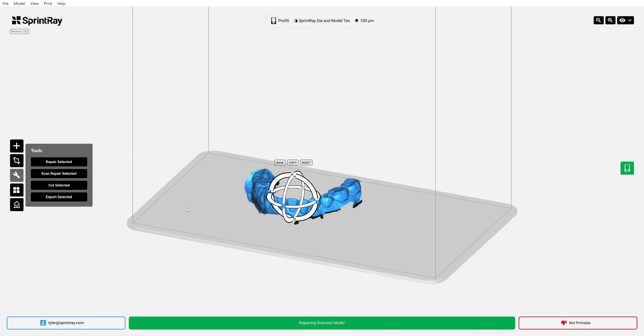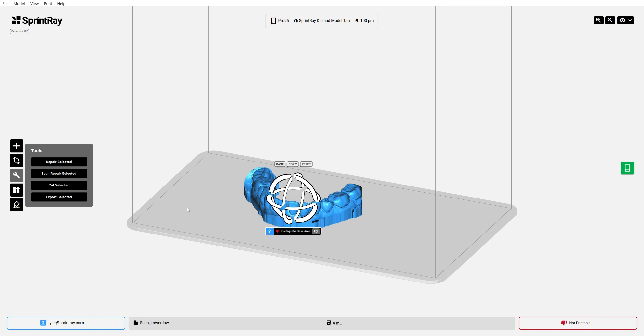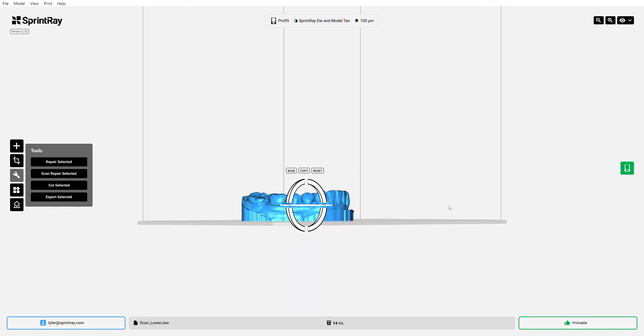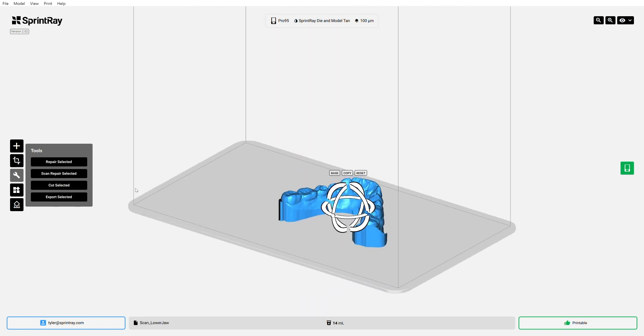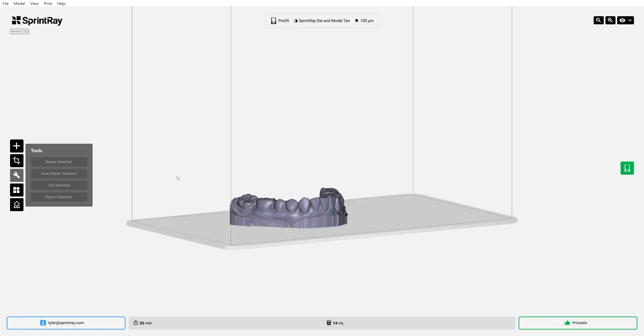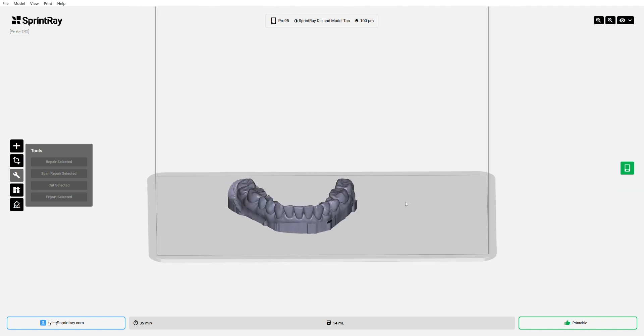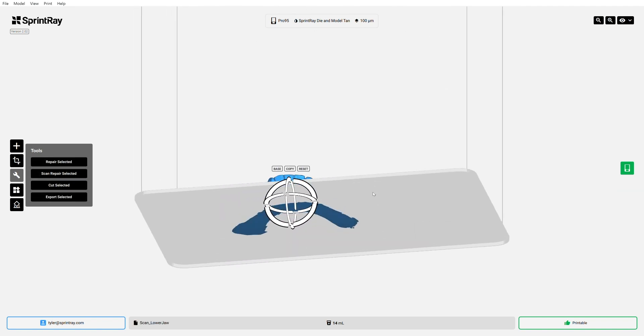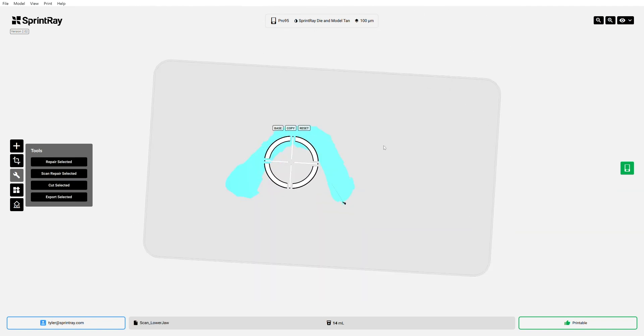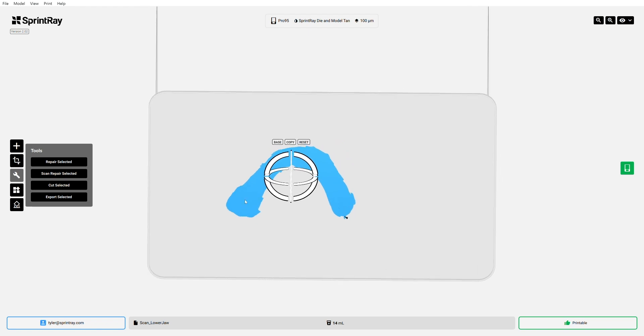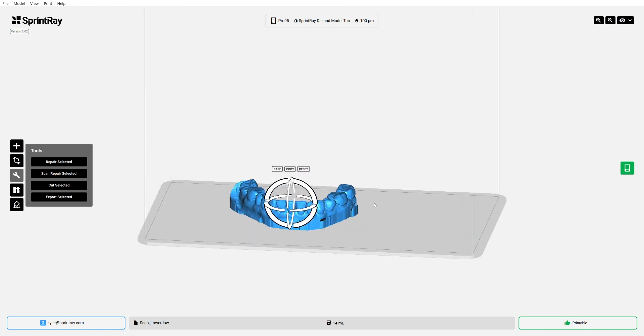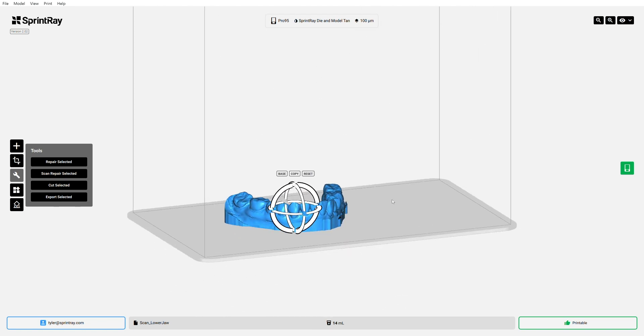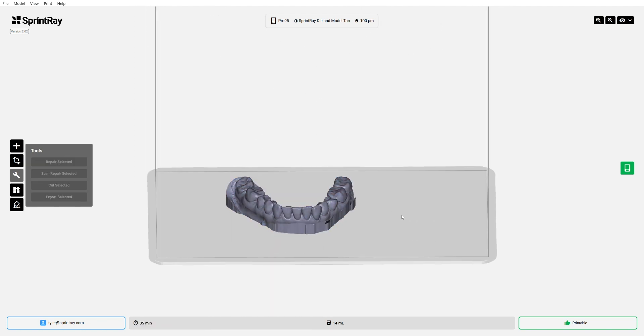Rayware is now going to automatically close this scan, and it's also going to put on this beautiful base. This is going to be a nice, flat, level surface. It's going to adhere perfectly to the build platform. And I can verify this by selecting the model, looking underneath. This beautiful horseshoe right here means, yep, this is going to print no problem. And Rayware is no longer flagging any issues. That's fantastic.